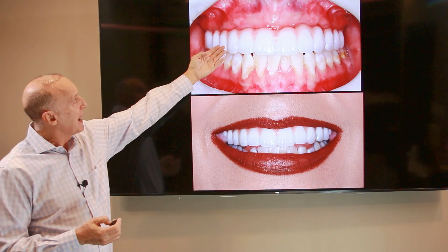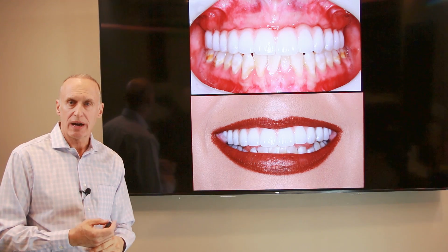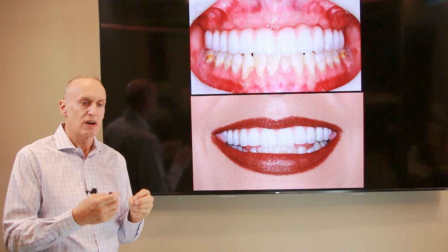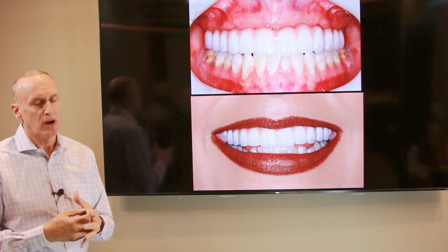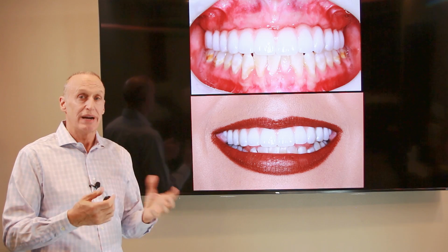And so after 2.5 months, you can see how much pink there is on the final restoration. It doesn't really negatively impact her smile because the pink matches her pink, and the prosthesis is convex where it touches the tissues. So again, a lot of people get super hung up on having pink. This is the one thing that might be in my control for you, the patient, or might not be in my control.